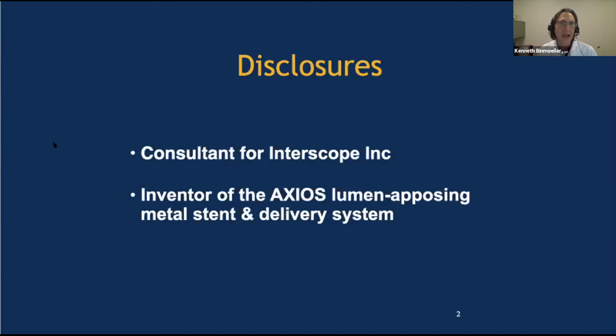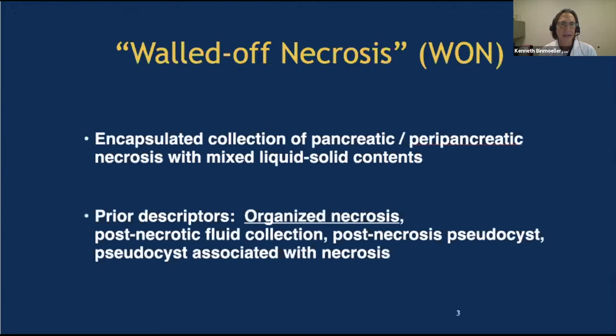So the EndoRotor that you will be hearing a lot about this afternoon is the first tool that we can introduce through an AXIOS, a lumen-apposing metal stent, to target this specific therapy of necrosectomy. So let's talk about walled-off necrosis first.